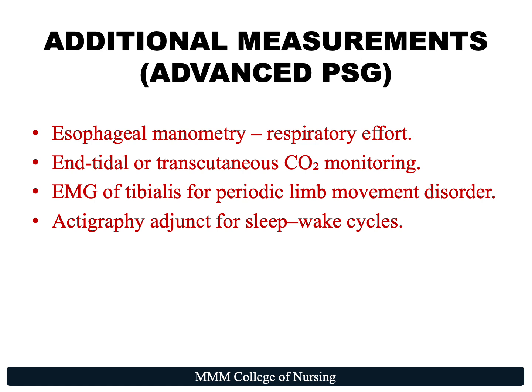Let's look at the additional measurements that are used in advanced polysomnography. Esophageal manometry uses a catheter to measure esophageal pressure, providing precise respiratory effort data to diagnose sleep disordered breathing, especially upper airway resistance syndrome, and differentiating central versus obstructive events.